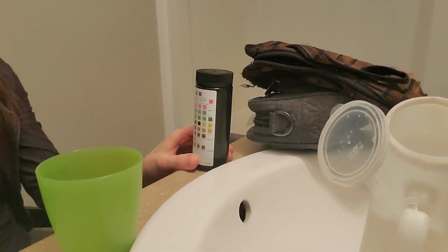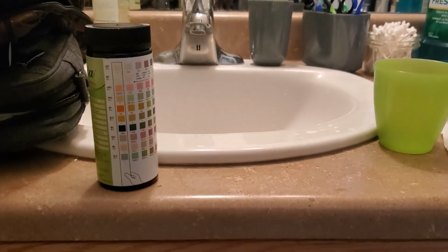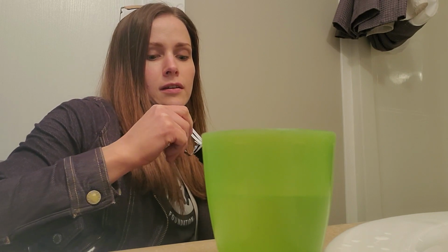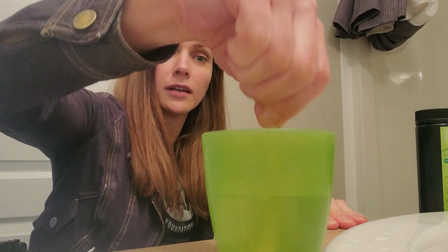And I went to the bathroom in my container. And then I, this is gross, but I have a cup that's designated for my pee. So I pour a little bit of pee in there, which is gross, but necessary. I take them out. You have to take them out really fast because they can't really touch air. So grab one fast. And then put the lid back on as fast as I can. And then I dip it, run it along the edge, and then hold it sideways on a piece of paper towel. You can't really see.